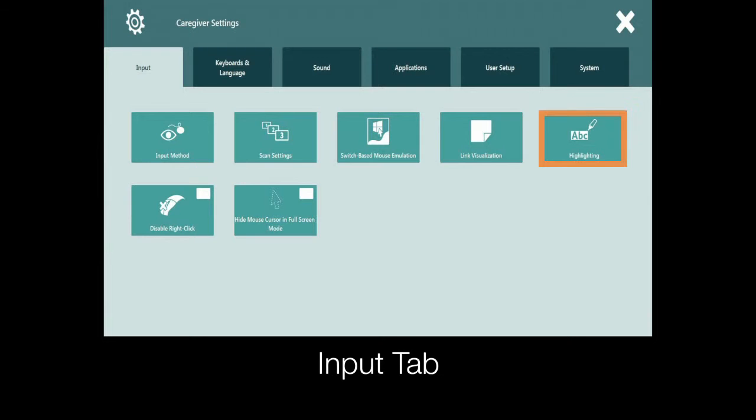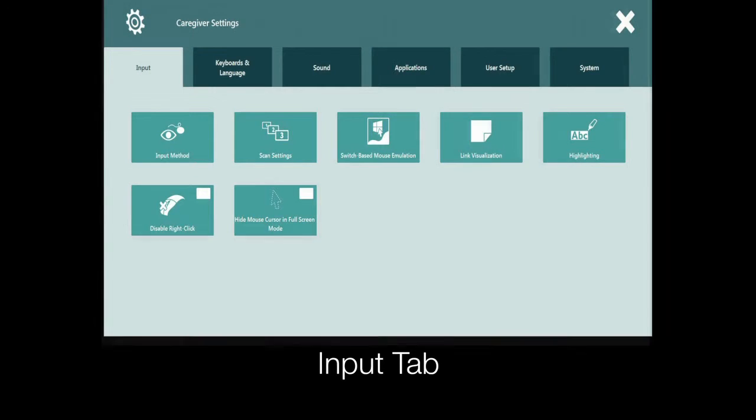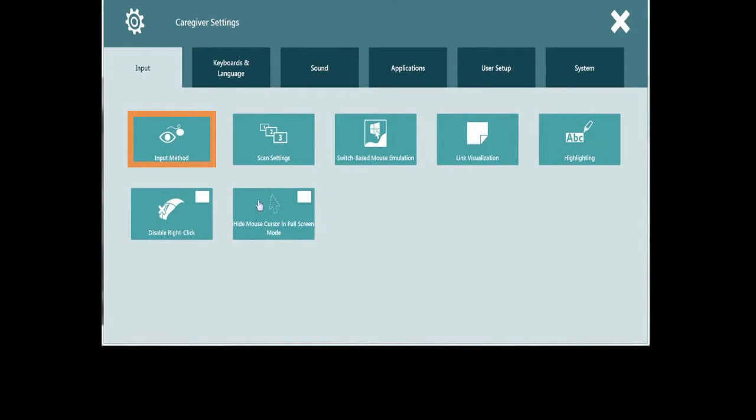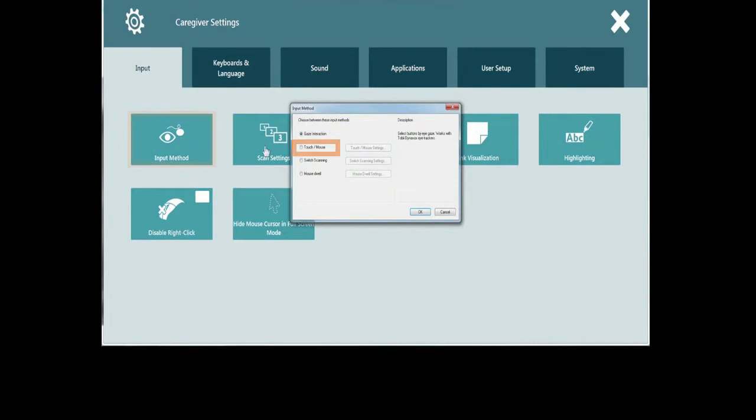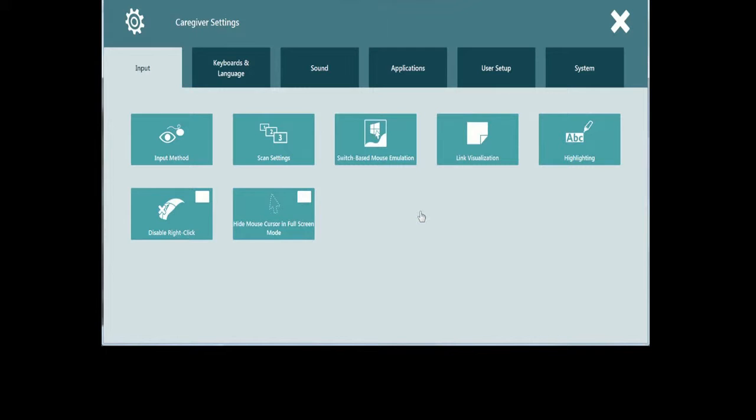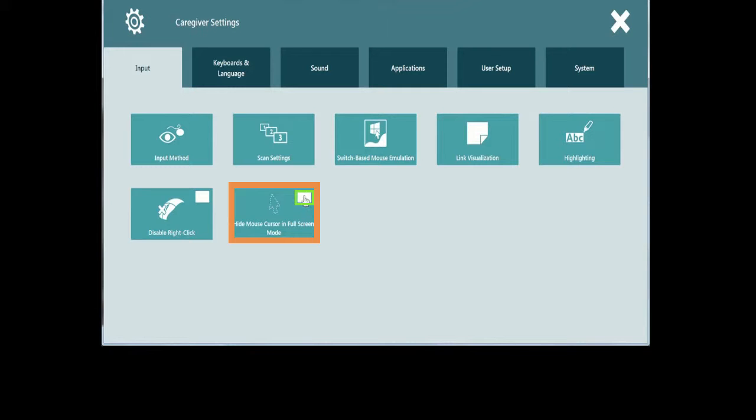There are also settings to establish the visual feedback that the software will provide during communication. To get to the specific menu settings, touch the button, make your desired changes, and then select OK. For some of the settings you will see a checkbox in the upper right corner. This will toggle the setting between on and off.